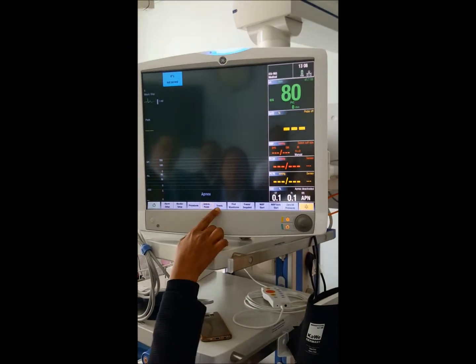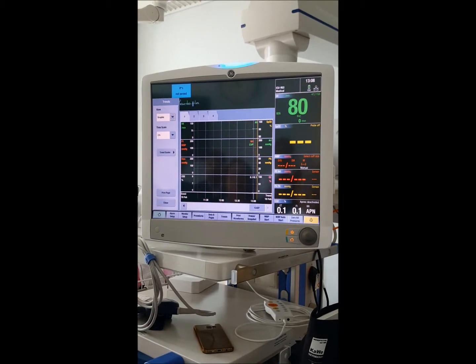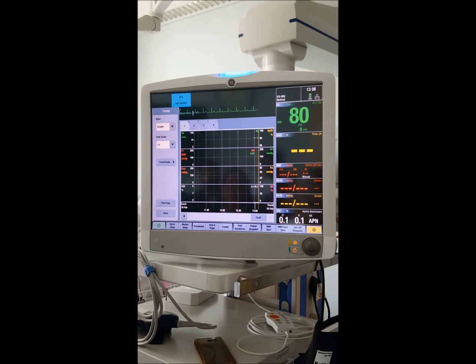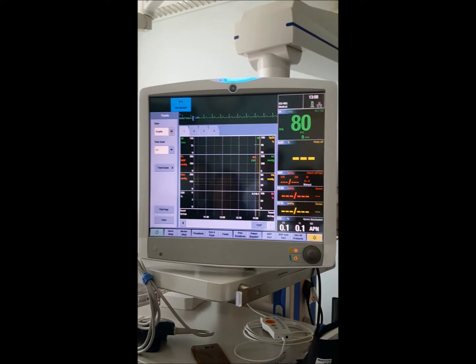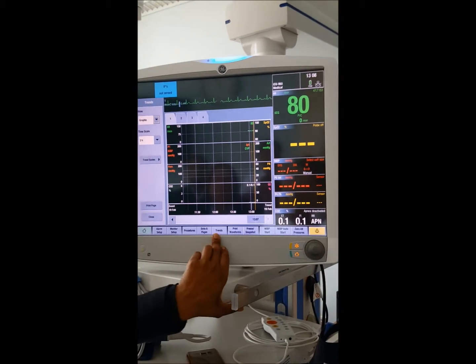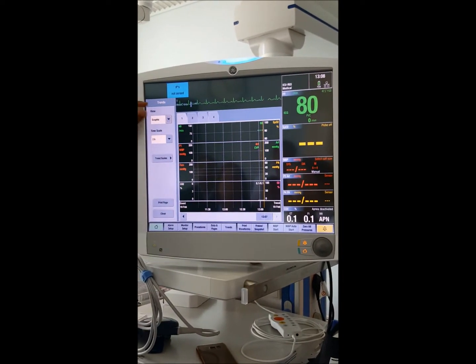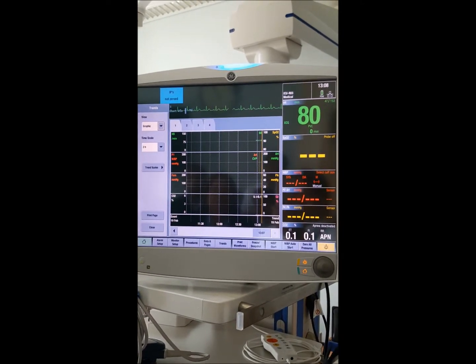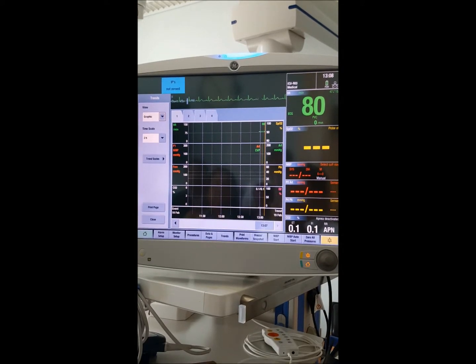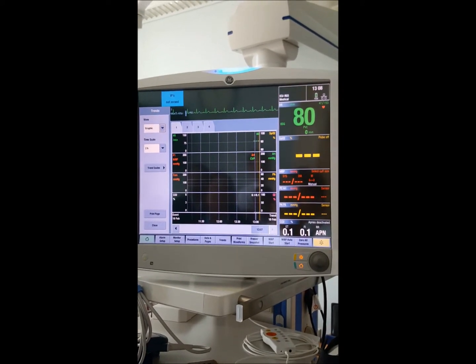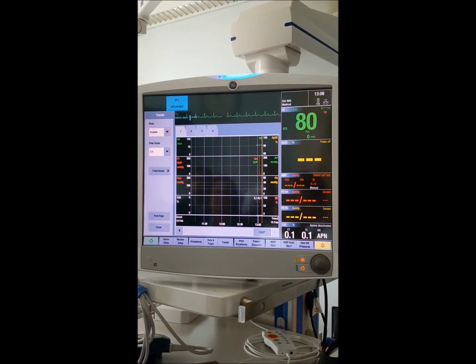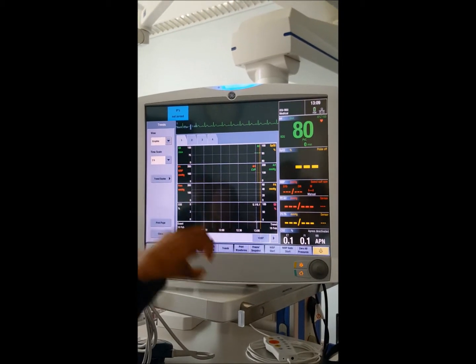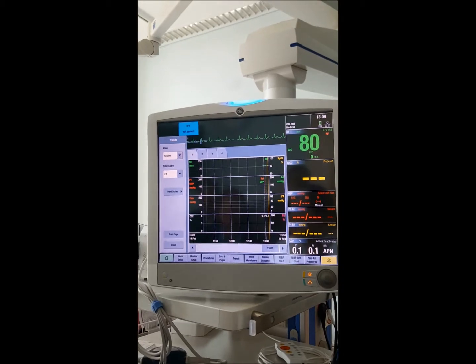Next is Trends, which is very important — it shows the history of the patient, such as what happened one hour or five minutes ago. Doctors ask for this history during rounds. There are different views for trends. The first is graphical history: 24 hours is stored in the monitor, but in the central monitor you have up to 72 hours, since patients tend to stay in the ICU more than three days.